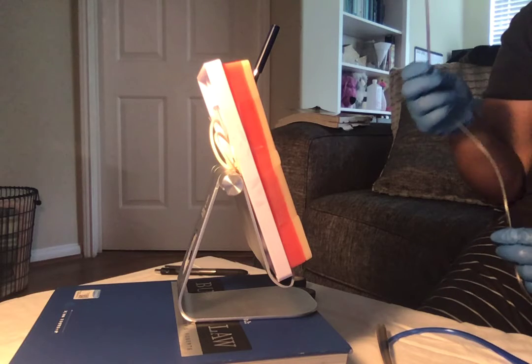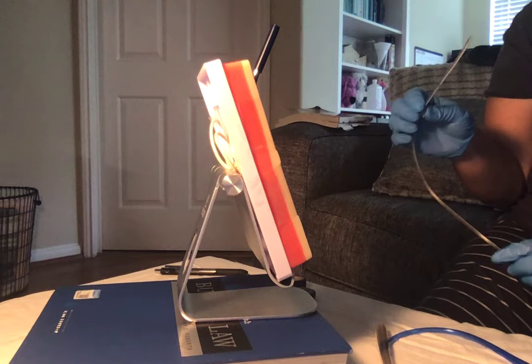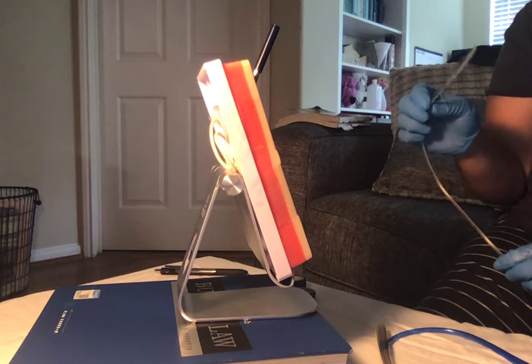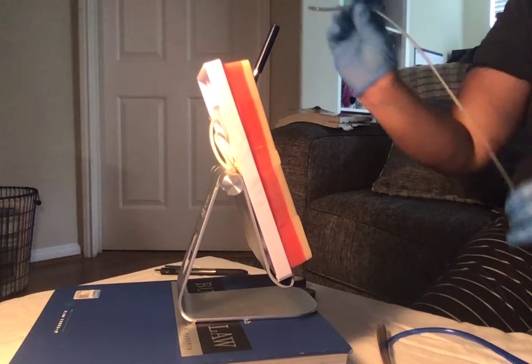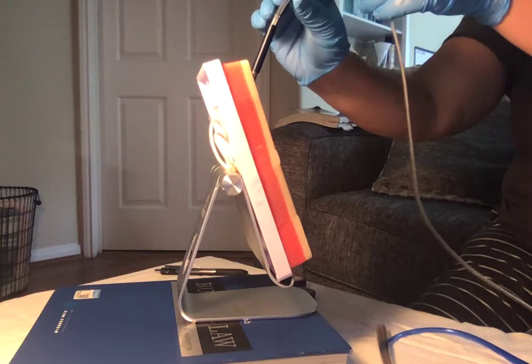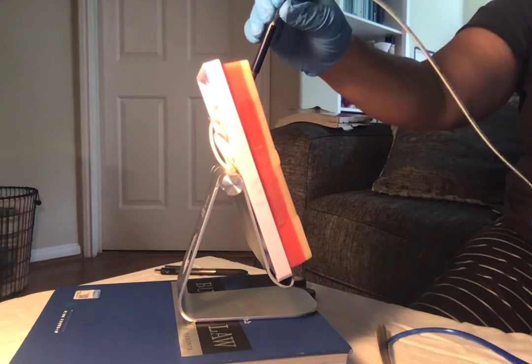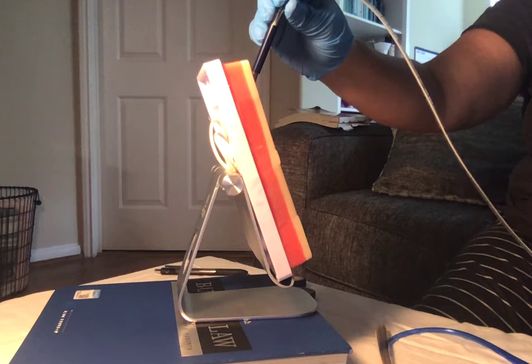I'm then going to let the patient know the insertion is about to begin and ask them to extend their head back against the pillow. The patient will be in a high Fowler's position. I'm going to insert the tube slowly through the nares and the curved end pointing down towards the ears. If resistance is met, I'm going to apply gentle pressure downward and advance the tubing.